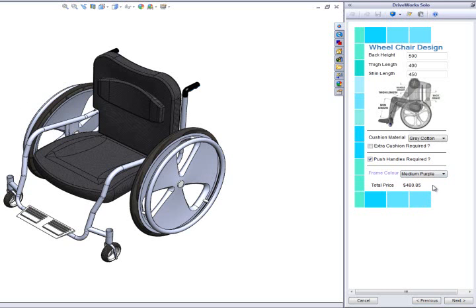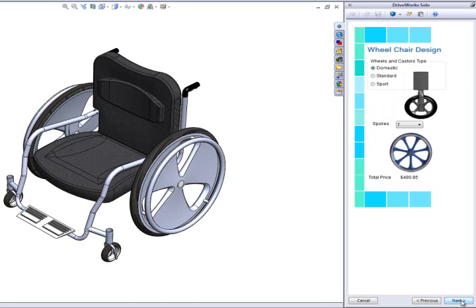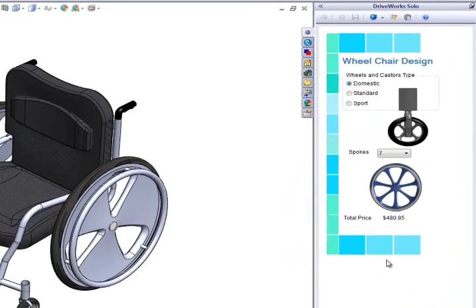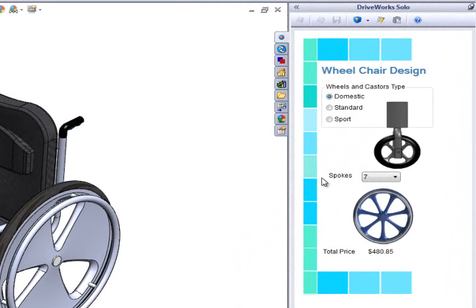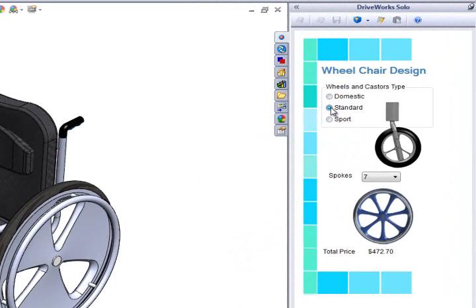We are then provided with an indicative price so far. Now we can pick the type of caster wheels we would like. As we make our selection, the image is updated.